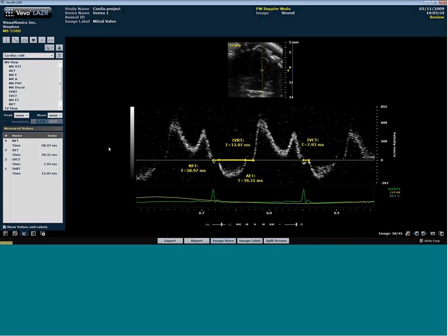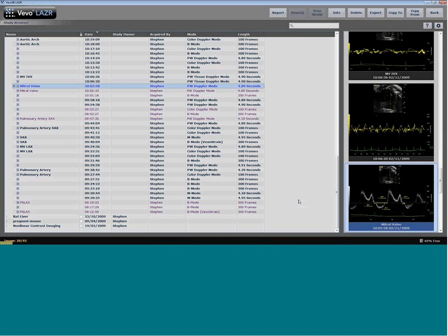I'm just going to take two questions that came in from different listeners, both about anesthesia, so I thought we could probably tackle both of them at once. One just asking which anesthesia is used. Now, I'm assuming that's for the majority of the images we see here, and I think you mentioned isoflurane. Yes. The question again was just about, for optimal imaging, should the inhalant isoflurane be controlled as shallow as possible, or do you have an optimal isoflurane flow rate?